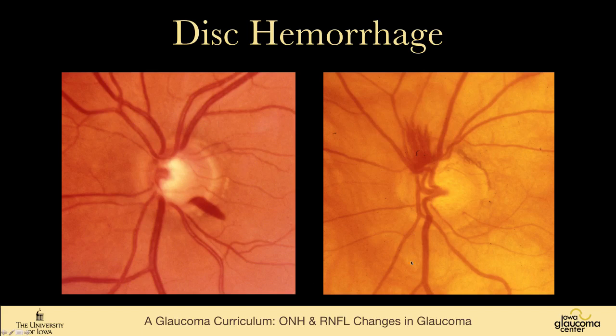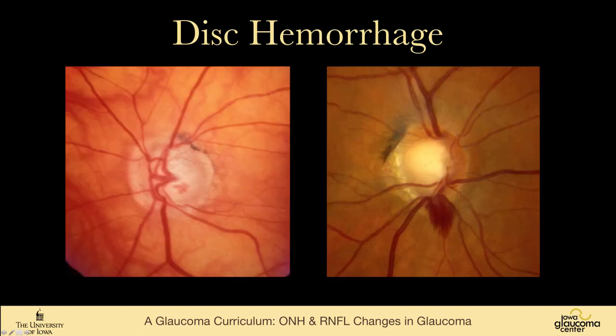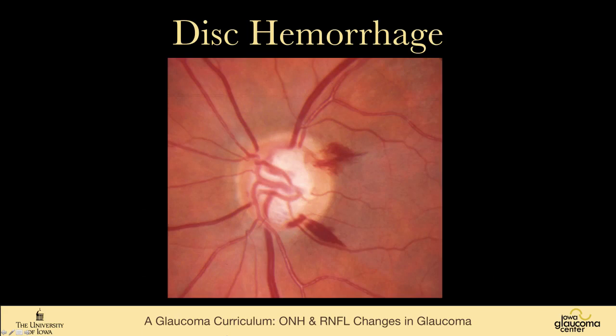Just a few examples of disc hemorrhages. You can see the flame-shaped nature of this because the hemorrhage is in the nerve fiber layer here. This image on the left, you can see a deep hemorrhage just inside the optic nerve. And kind of an unusual patient with 2 disc hemorrhages.